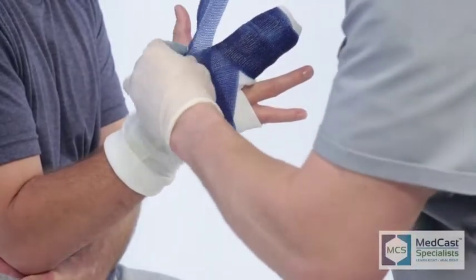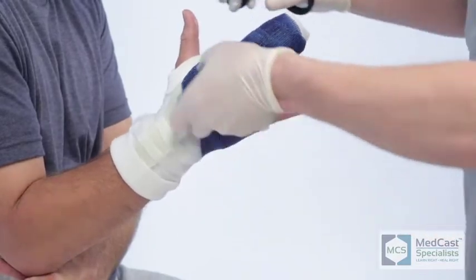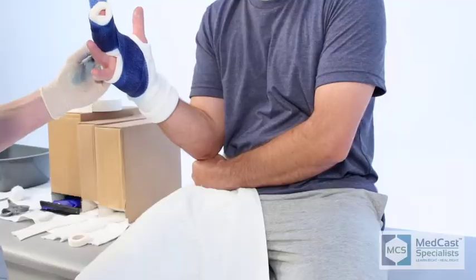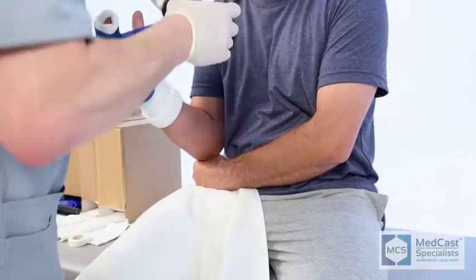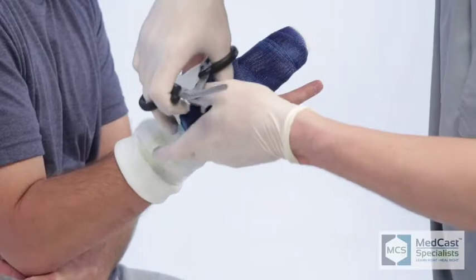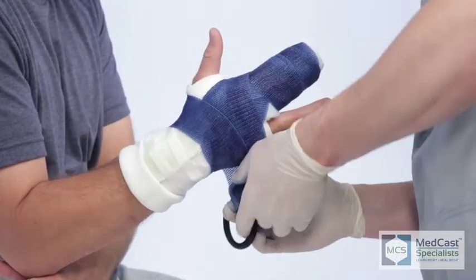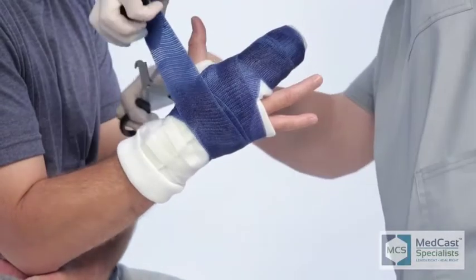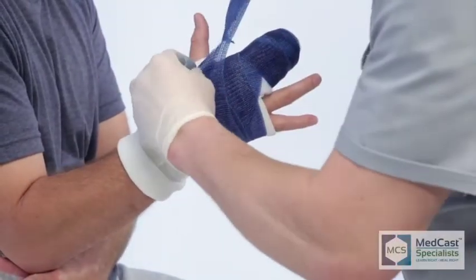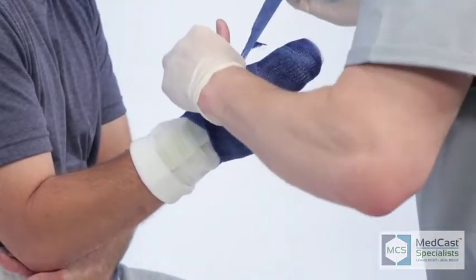One little pearl that you'll want to pay attention to: when he put the cast material in the pan, he didn't leave it in very long and he didn't squeeze it very hard. Oftentimes I've even gone as far as to just get my hands wet and hold the material in my hand so that it doesn't dry. The last thing you want is the end of the cast material to start to harden up on you. It makes it impossible to go through the web spaces and around the fingers. So it does take a little bit more time. If you have a roll that's going to set up rather quickly, you will be in a little bit of trouble, so you have to wrap fast.